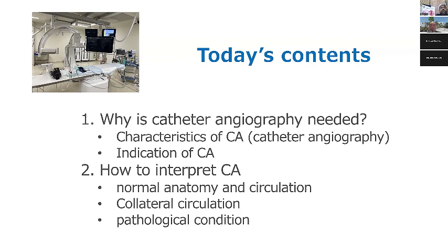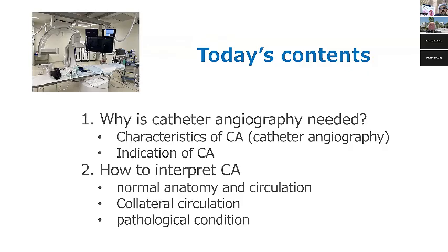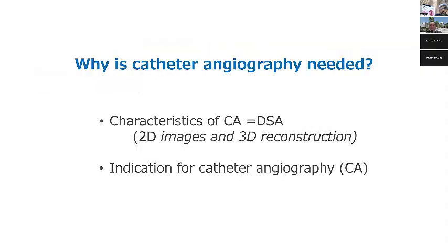Before entering the main topic, I will mention why catheter angiography is needed, the characteristics of catheter angiography, and the indications for catheter angiography. Okay, let's begin with why catheter angiography, or CA, is needed. To answer this question, it is necessary to know the characteristics of catheter angiography and its indications.